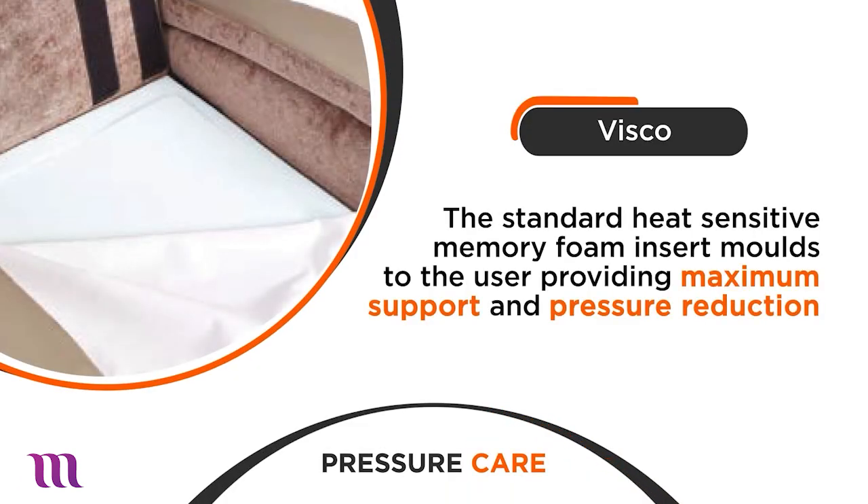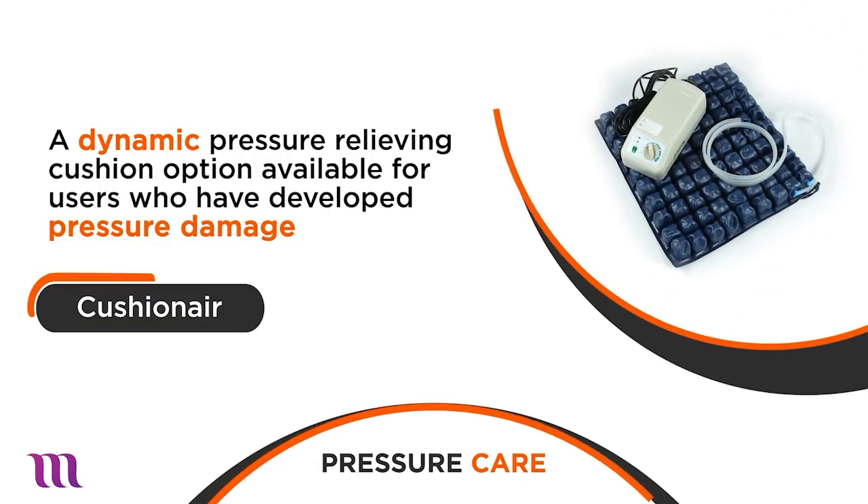These options include Visco, a heat sensitive memory foam for maximum support and pressure reduction, and Cushion Air, an air cushion developed for users with pressure damage, giving additional comfort and support.